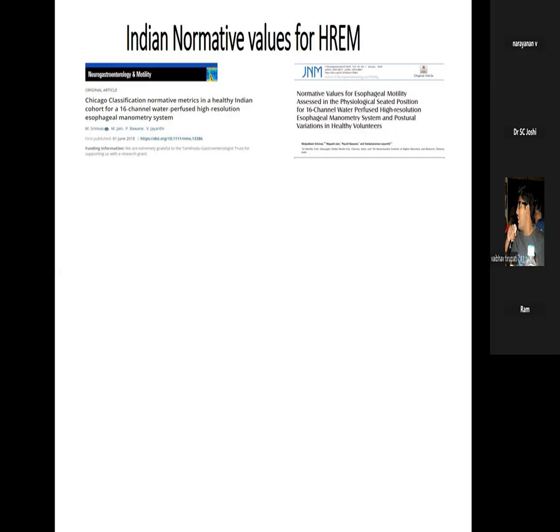So we did both sitting and supine water swallows in the first instance and reported them as two papers, the supine in Neurogastroenterology and Motility and the sitting in the Journal of Neurogastroenterology and Motility. I split them as two papers simply because putting them together was too big and the information was very important. I won't keep you in suspense. I will show you what we found.